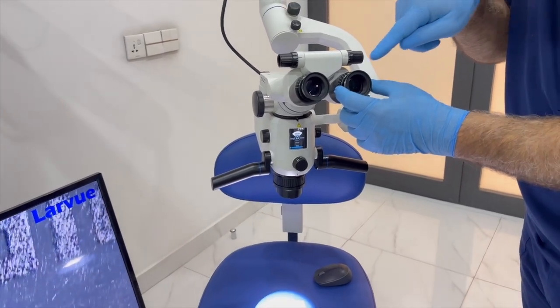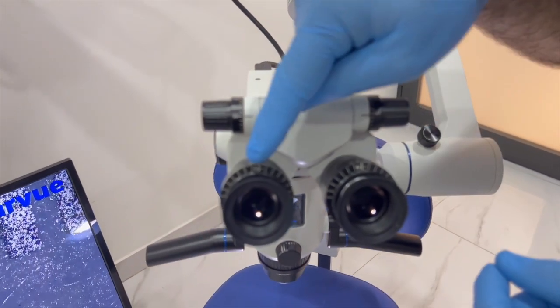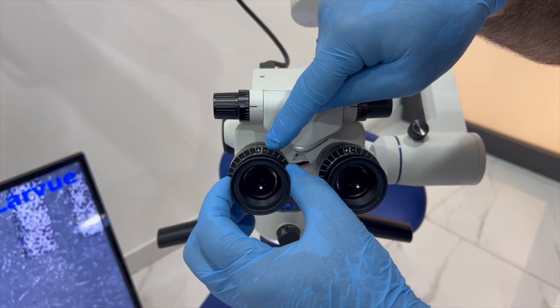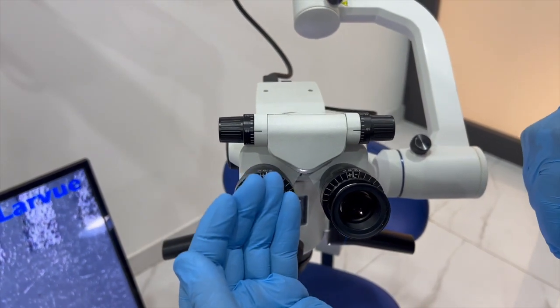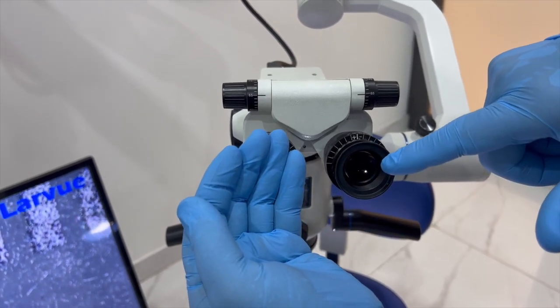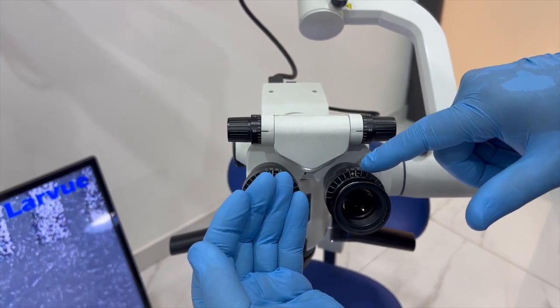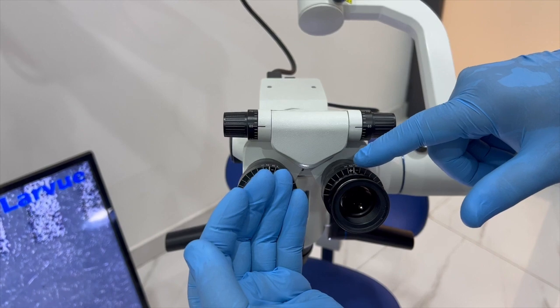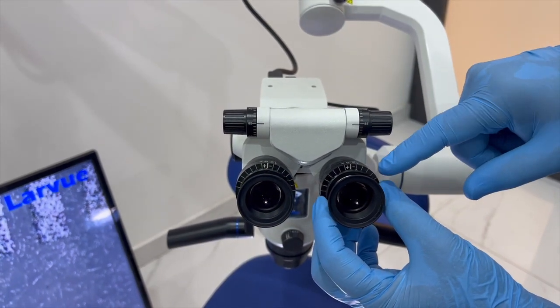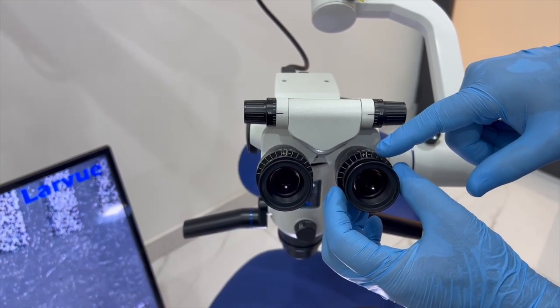Then I will go to the eyepiece. Look at the eyepiece. So in the eyepiece we have diopters. Okay. So I just set the diopter to 0, both eyes to 0. Then I will close my left eye and look inside the viewfinder. If I see a sharp image, no need to play with the diopter. If you feel, for example, something is wrong, or you find the picture is not sharp, just rotate the diopter to the right or to the left until you find the sharp image.